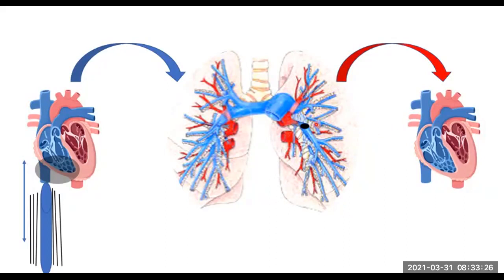But this is something, have you guys heard of VQ mismatch? All right? This is a very typical example of a VQ mismatch, which means perfusion. What's it?